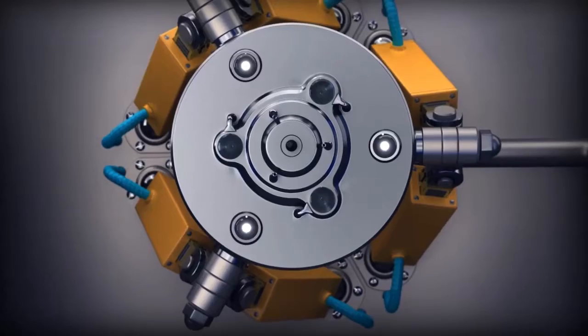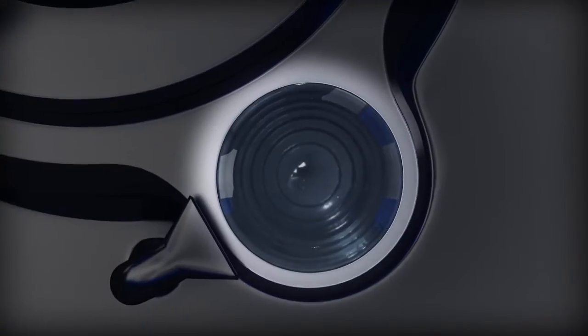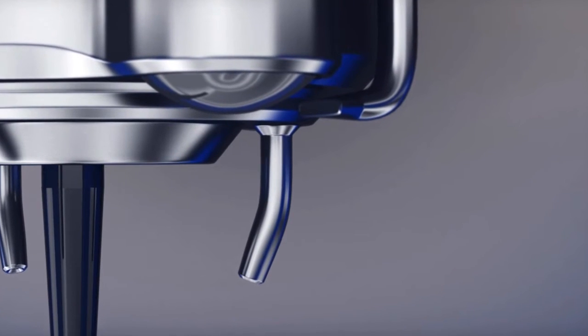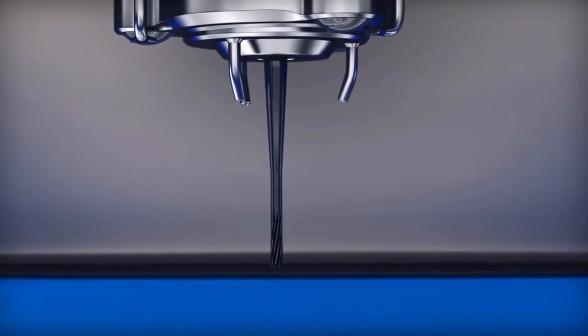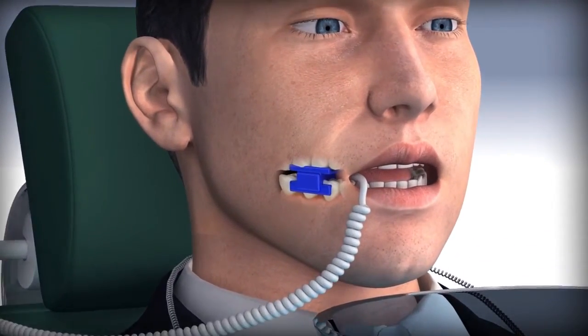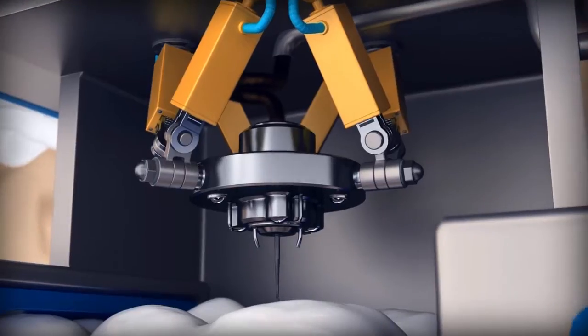Inside of the device are servo motors that move the head, which houses miniature cameras, LEDs, nozzles for water and compressed air, and a drill that rotates with a speed of up to 100,000 rotations per minute. The device is firmly fixed within the patient's mouth and does not alter its position during the entire operation.